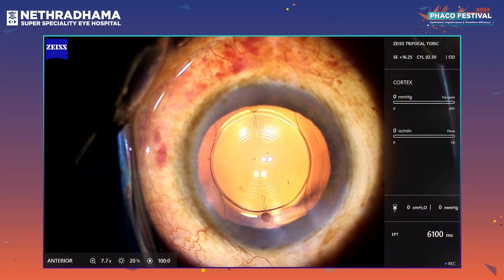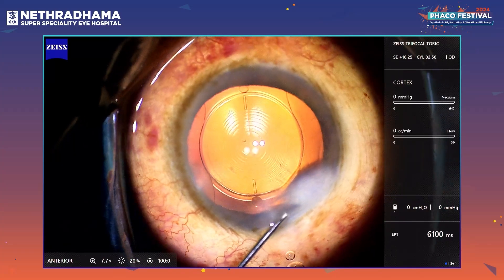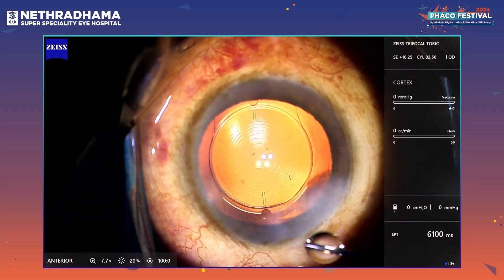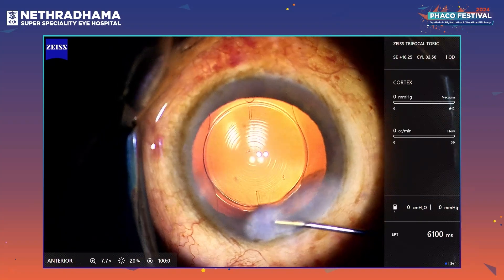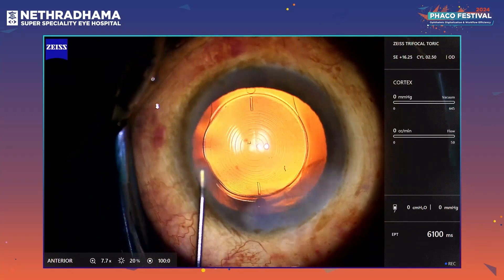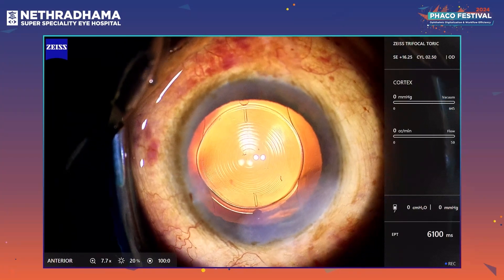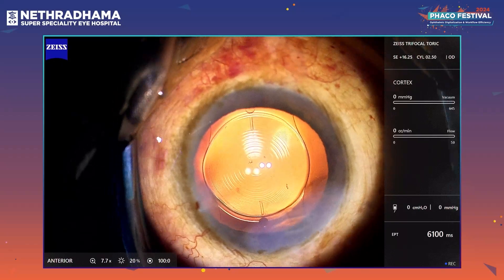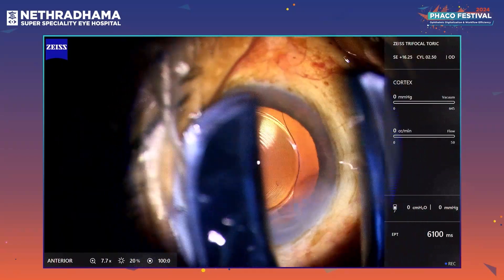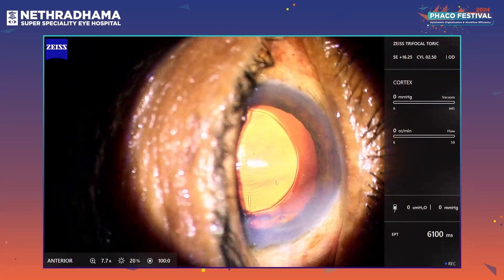That's the end of the surgery. I have a beautiful surgical cockpit here — it consists of the Quatera 700, the Chilisto, and the Artivo 800. It gives me full control as I'm doing the surgery. I can see all the patient details on the Artivo 800 screen, and my assistant can see the entire surgery on the screen of the Quatera 700. It's extremely comfortable — that's the end of the case. Thank you very much.